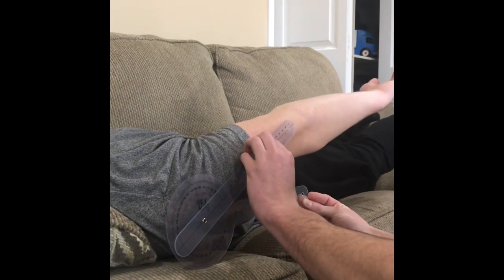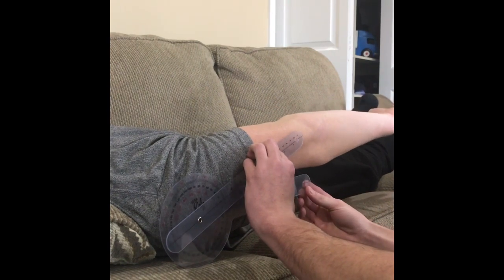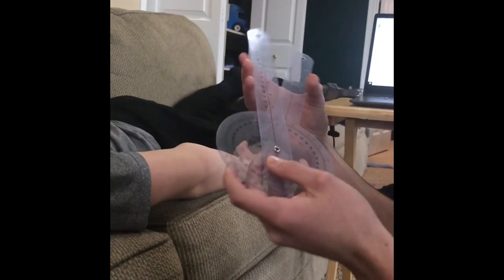When the time comes, you're going to ask your patient to extend their arm or flex it backwards. You can go ahead and raise it into the air, please. And line it up with the humerus. Make sure that they're not recruiting any of the extra muscles to get a little bit of extra movement. All right, you can go ahead and relax. We have 17 degrees of movement.